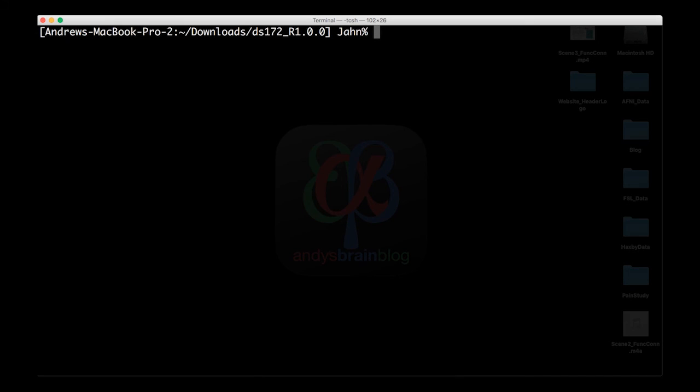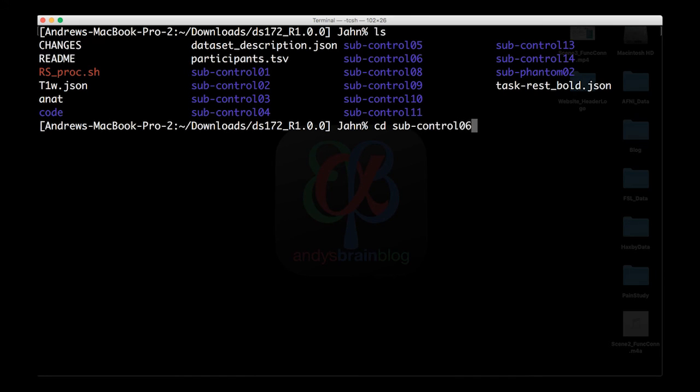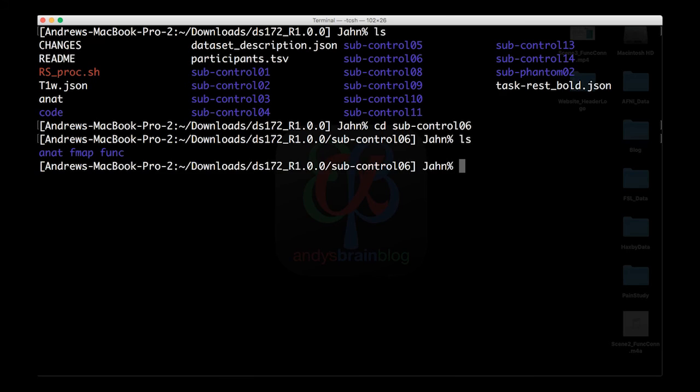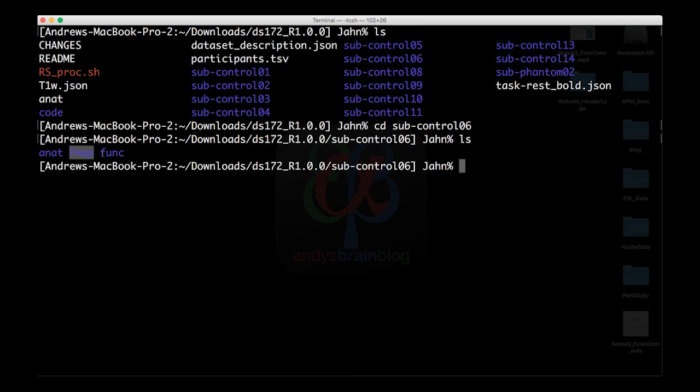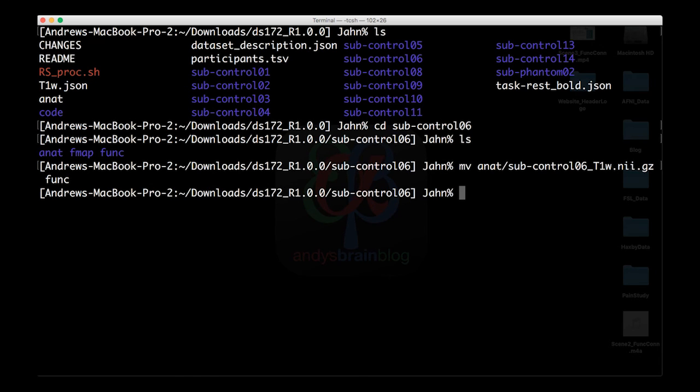Once you've downloaded and unzipped the data set, you'll notice that there are 12 individual subject directories. For this demo, I'm going to go into sub-control-06. And within this directory, there are three sub-directories. Anat containing the anatomical image, fmap containing the field maps, which we're not going to deal with right now, and func containing the resting state data sets. Just so I have everything in the same place, I'm going to move my anatomical image into my func directory.